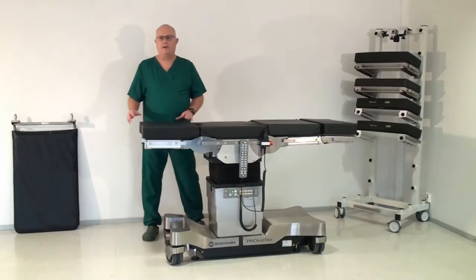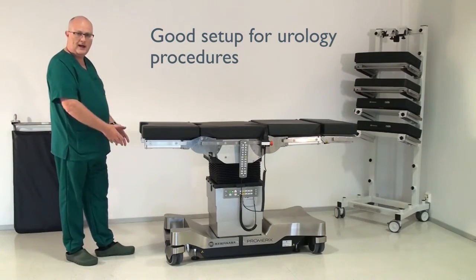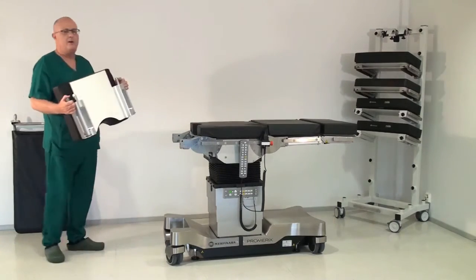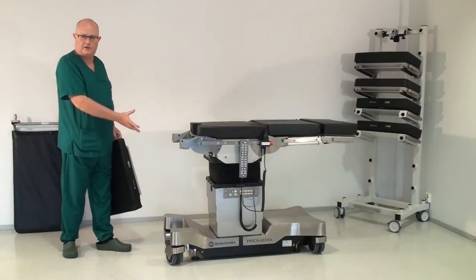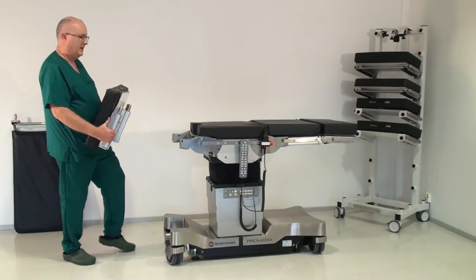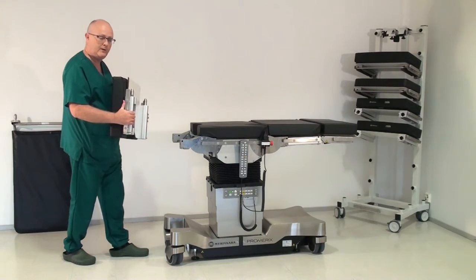This is great for something like urology because you have the patient right off the end of the table and you've actually got access. Or there's a second pelvic cutout here where you can take this section out, put an infill section in here, and then you can have the patient close to the table. And the idea is to make the table smaller. So if we show you this setup with the patient to see what it looks like, you'll see why sometimes the anaesthetists complain that they have a lot of difficulty with tables.